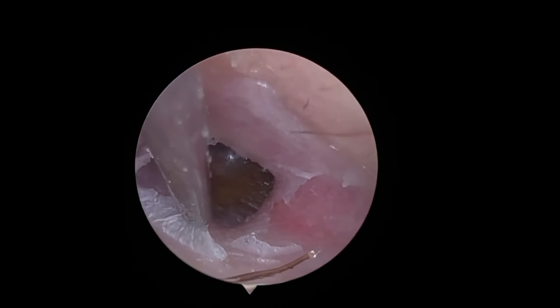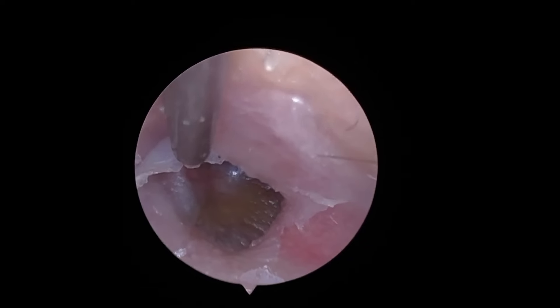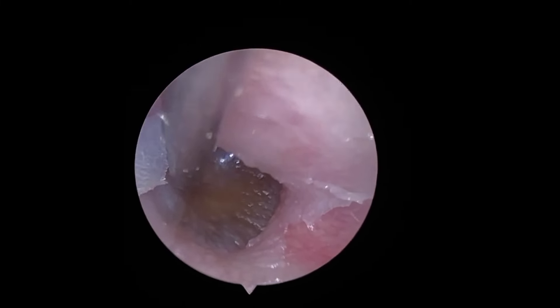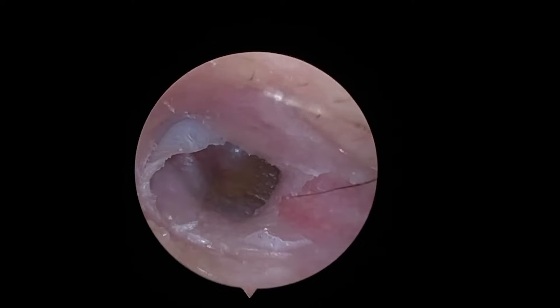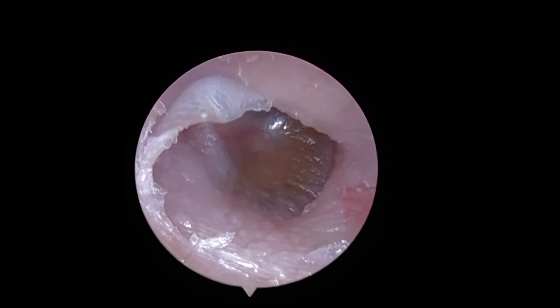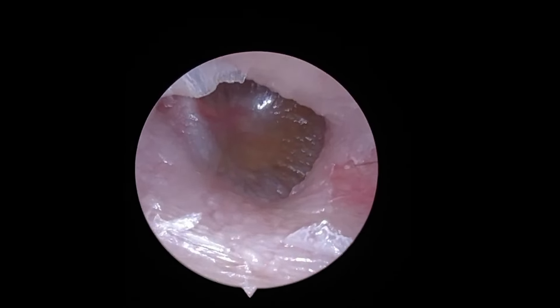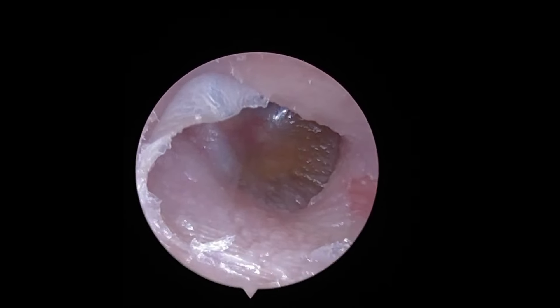All of the bits of keratin have gone straight into the tube, so no still shots of any of the extractions on this side I'm afraid. Here is a final shot of the right ear. There is a yellow-brownish hue behind the eardrum, and Lord Mace Tyrell has fluctuation in his hearing, which immediately indicates to me that there is some sort of fluid behind the eardrum, as it can take on a brownish-yellowish appearance sometimes. There are no bubbles visible, but the eardrum looks off and his hearing certainly goes up and down very suddenly, so he has been referred for this.